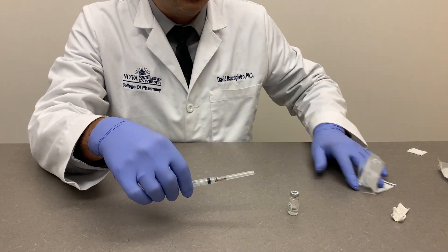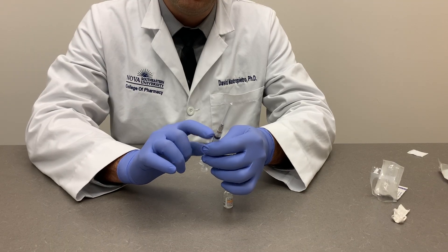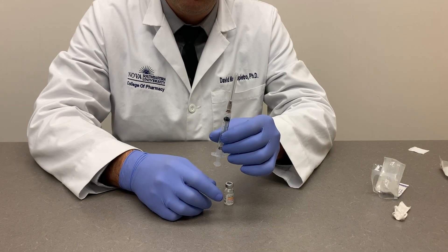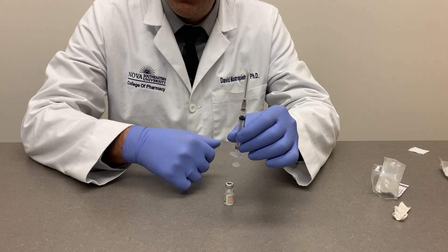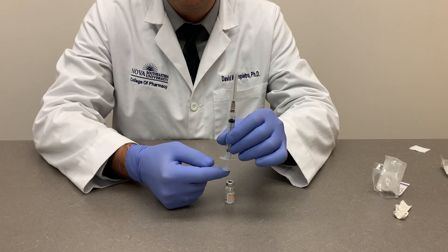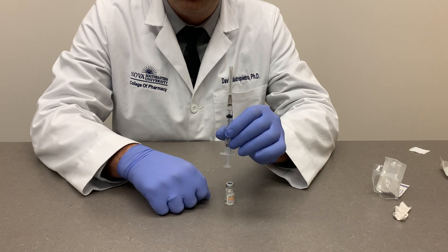The next step is to withdraw the dose. Sometimes it's preferable to pull a certain amount of air into the syringe first. The syringe plunger may have been in one place for a long time, so push it forward slightly to get it moving. Then pull back the amount of air equal to or slightly less than the volume you need to withdraw. For example, if drawing 0.5 mL, you can pull back to the 0.5, 0.4, or 0.3 mL mark. The less air put into the vial, the harder it will be to withdraw the dose.